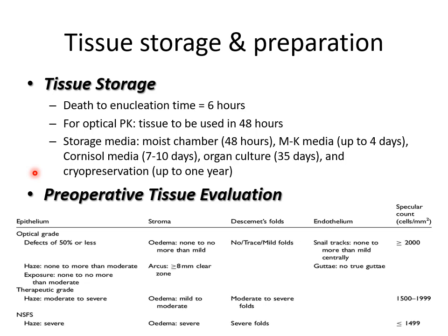Now, when we are talking of the cornea, of the corneal button, I keep on saying the word button because that is the terminology that you use when you go to a deceased person to extract the cornea. You either enucleate, which was usually done previously. Now, mostly what they do is they just take out the cornea and a little bit of scleral rim and keep it in the moist chamber and bring it back in order to be transplanted. So that term I'm using repeatedly, that is basically the corneal button or the corneoscleral button, right?